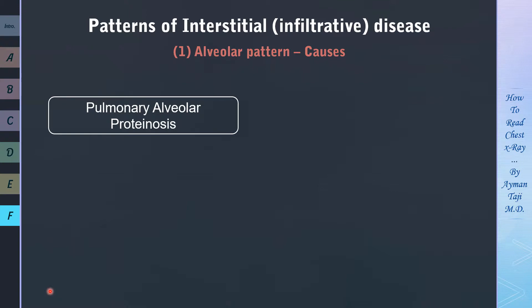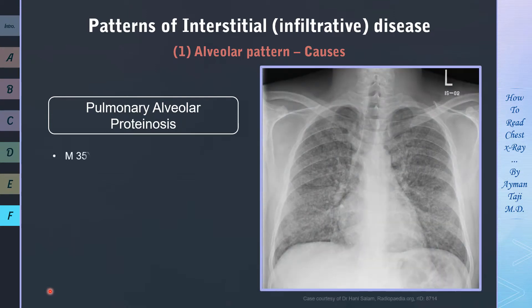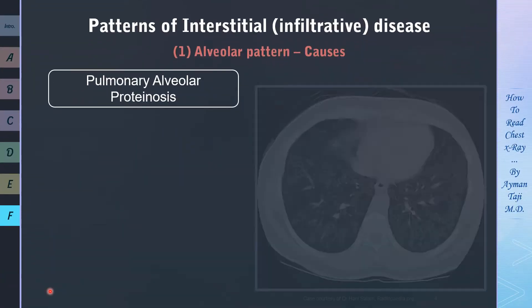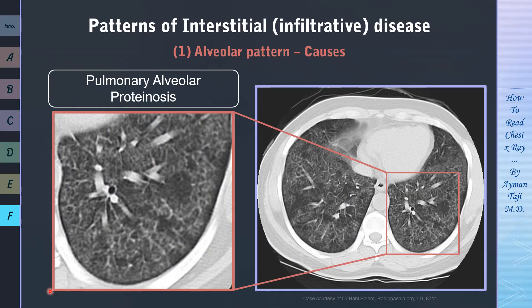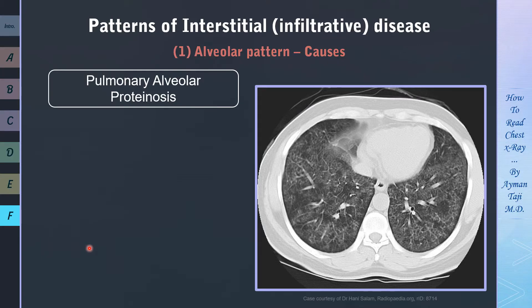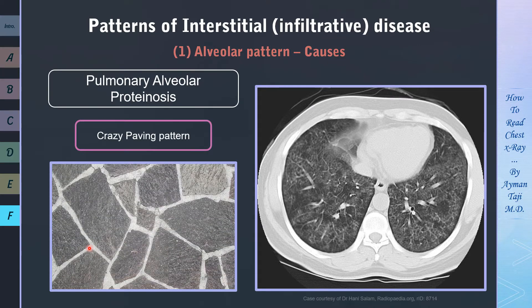A rare but very characteristic cause of diffuse alveolar opacities is pulmonary alveolar proteinosis — a rare lung disorder characterized by abnormal accumulation of surfactant-derived lipoprotein compounds within the alveoli. In this example, a 35-year-old male presents with shortness of breath for 5 days. High-resolution CT shows two main features: smooth thickening of interlobular and intralobular septal lines, and ground glass opacities. The combination of these two features is termed the crazy paving pattern, analogous to irregular-shaped paving stones superimposed on a background of ground glass opacity.